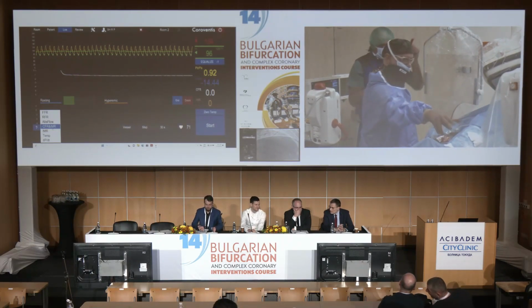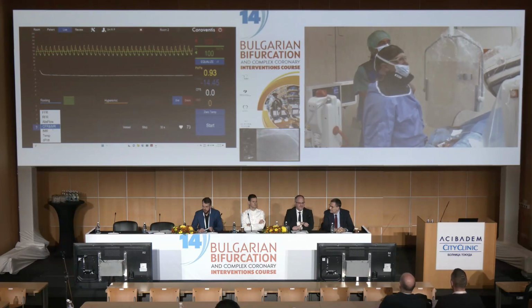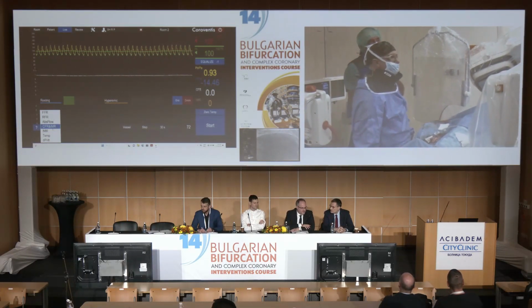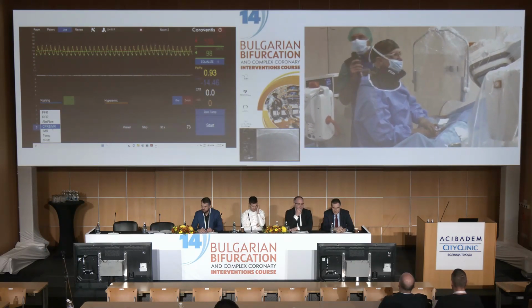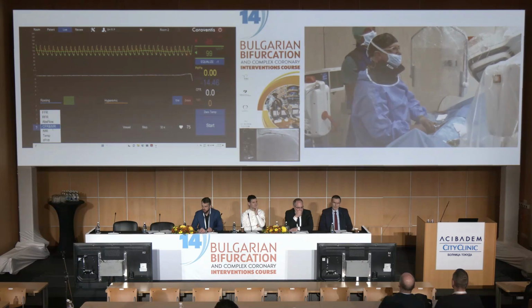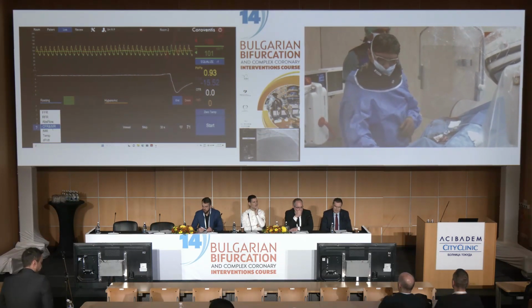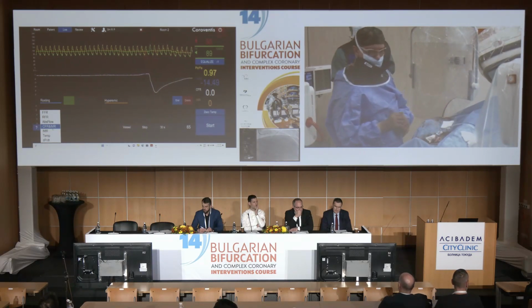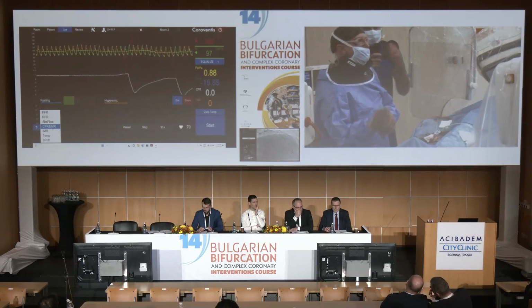Now, please keep your foot on the scopy. We are going to show where the marker is. The marker is in the LAD, but it can be put even more proximal. Pull back, please, and please give a test. It can be very proximal, even a little bit more. Why is it important? Okay, test. Fantastic. Good. We are all set.